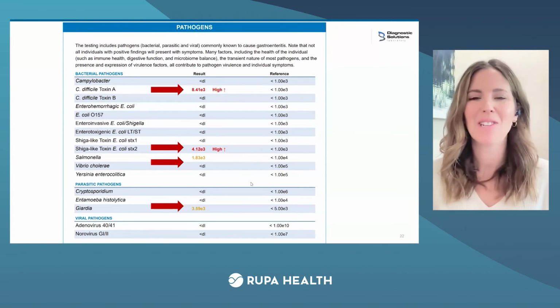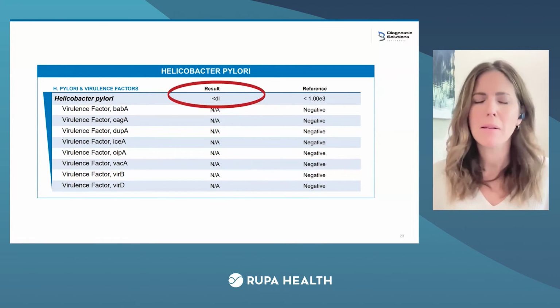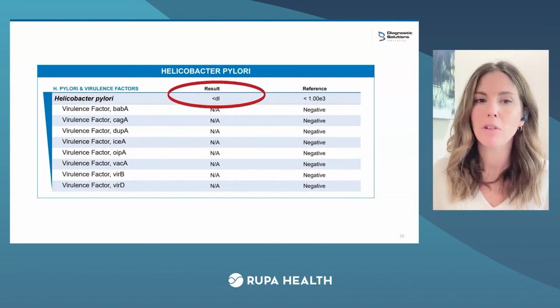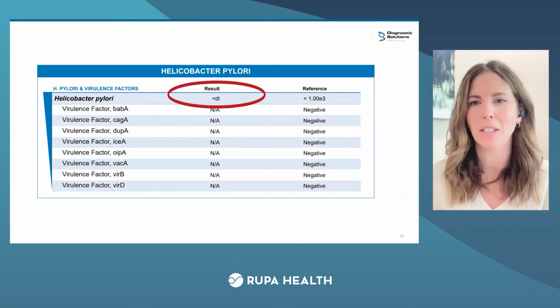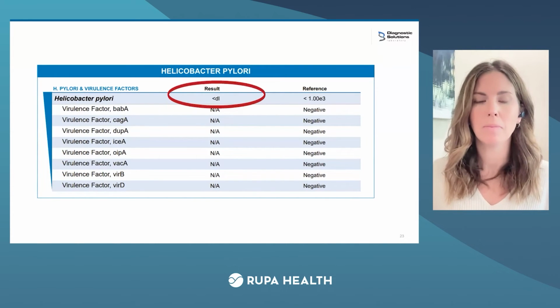Okay. Let's look at page 2, where we next would look at H. pylori. You see here, there's no number for H. pylori, meaning that it doesn't necessarily mean zero, but it means less than 100 organisms per gram of H. pylori, which is not significant. Now, for children at any number, I'm less likely to treat a child than I am an adult. So it takes more H. pylori for me to want to treat a child directly for H. pylori, unless they're extremely symptomatic.